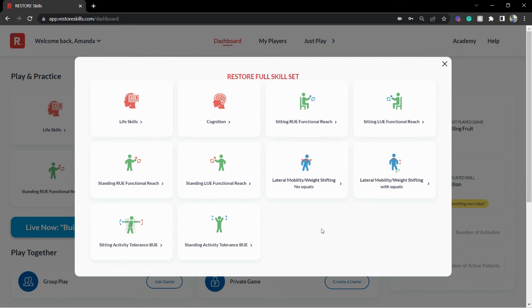So stick with this course, follow the rest of our videos, and by the end, you will begin to save data and track that progress over time so you can reach your patient's goals.